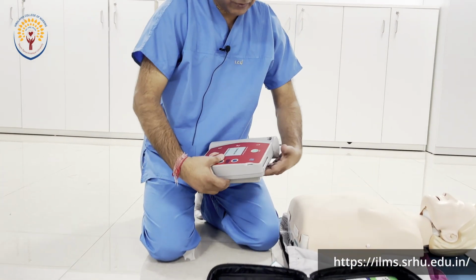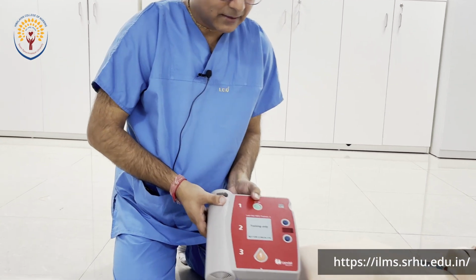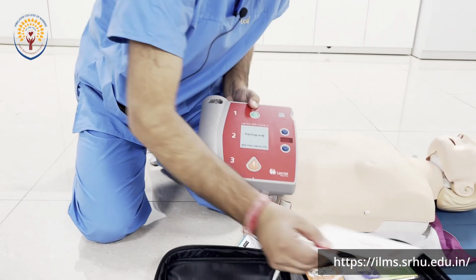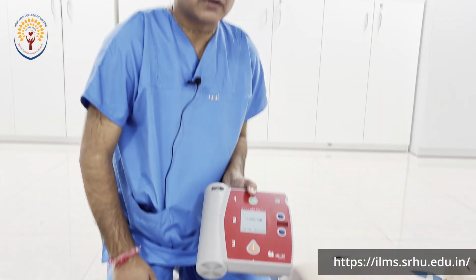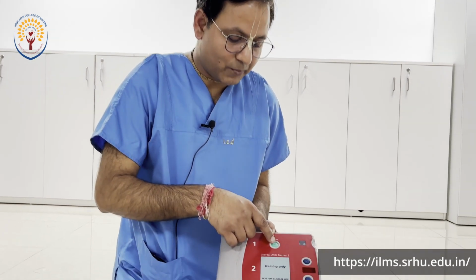Hello, we are here to tell you about the automated external defibrillator, that is the AED. You can see here, after unboxing the AED, you will find this AED, and another thing you will find is the pads, which come with the connection. As we take the AED to the patient and open it, first of all we have to turn it on. You can see the on button over here.